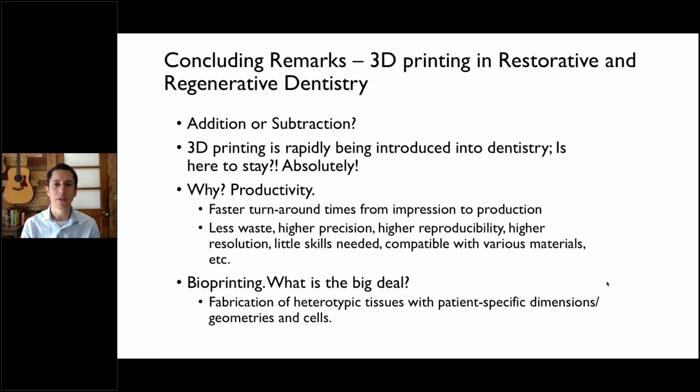So just to conclude then, on 3D printing in restorative and regenerative dentistry, I think we're going through a shift now where the question is, what is better, addition or subtraction? I think there are a lot of reasons to believe that additive processes have a lot of benefits, but the track record of subtractive processes is still pretty much unbeatable. For the next decade, I think we're still going to slowly migrate to additive manufacturing, and that's going to depend on a lot of data and information on the true benefits of these new processes.